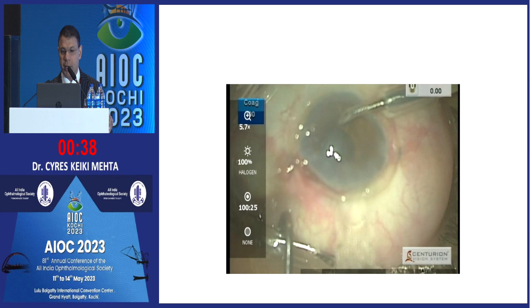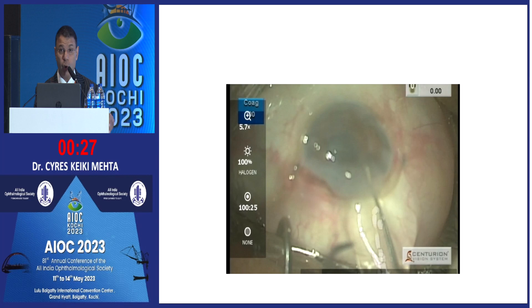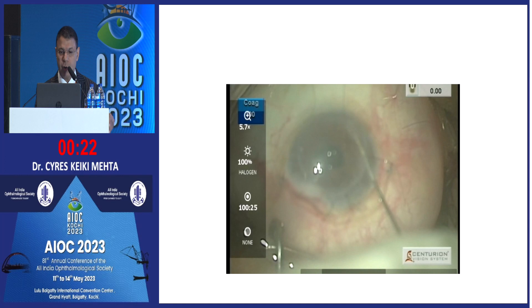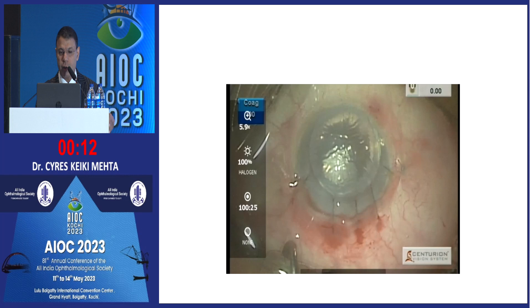Now the second part of the surgery — that is your graft getting into the eye. Close all the openings and make it absolutely airtight, then float it up. DSEK is a simple surgery to learn, especially if you get pre-cut grafts. It looks very complicated but it is not — you can watch videos and just do it yourself. Put all the sutures, make sure the air bubble stays, and this patient still comes back with pretty good vision — about 6/12.